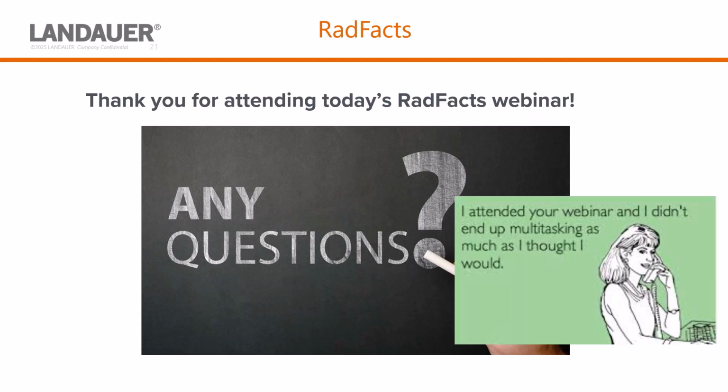Okay, so you want to return dosimeters as soon as you can. The monitoring period will be on your dosimeter. You want to return it as soon as that's completed. The reason is that if there are issues, if this is a high exposure, you want to be able to address that right away, and you want to do that investigation when it's fresh in that person's mind, instead of receiving it 6 months later and nobody knows what's going on.